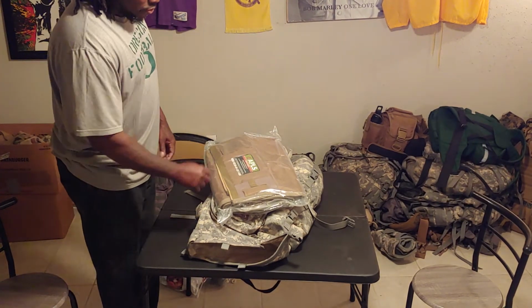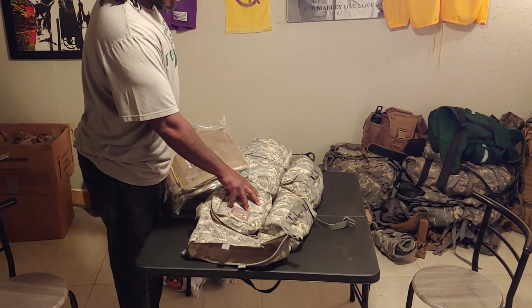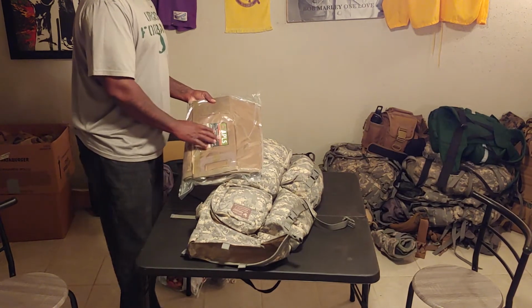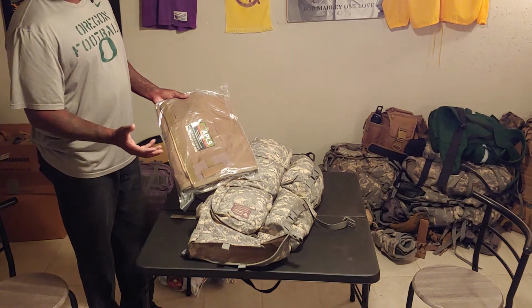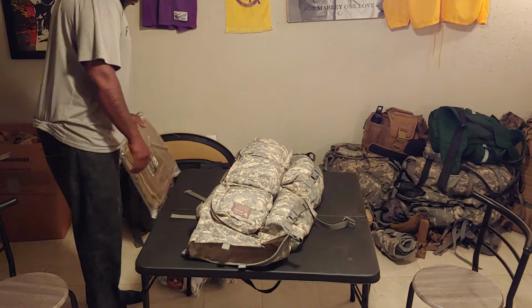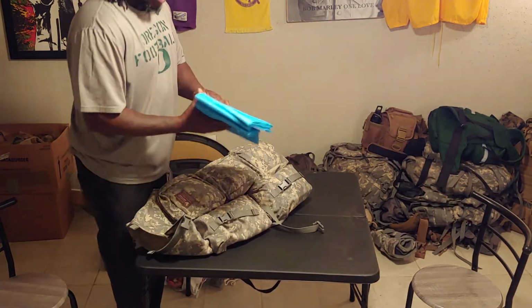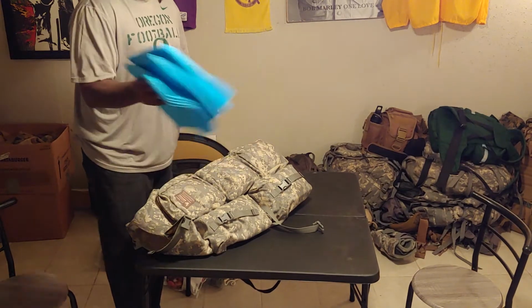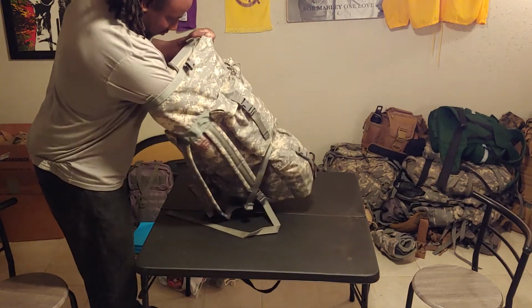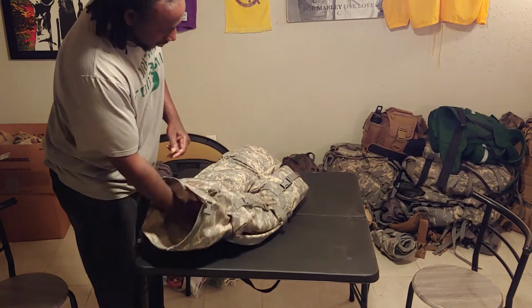And this is another reason why I had those little blue things in here that I say are for the blood. I could put this on there, you know, to help absorb some of the bleeding and fluids that may be coming from an individual, to try to preserve life. See, the doggy training pads. Got those in there for that purpose too. So I think that's everything that's in there. So that's everything inside. And like I say, that literally goes with that. It'll slide right in there.